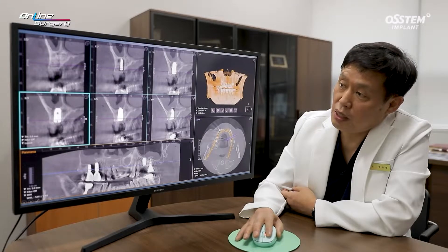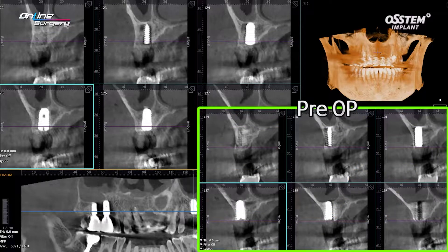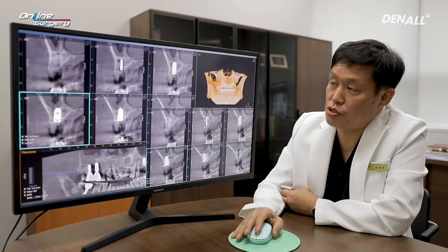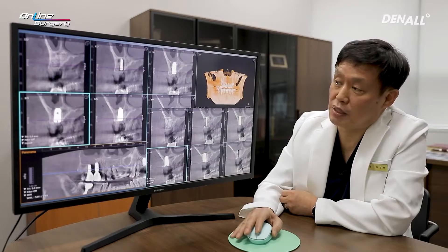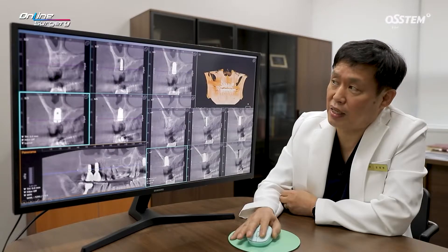In the post-op image, you can see space in the buccal area. I did not damage the buccal plate, and therefore I used autogenous bone graft materials. Buccal plate is still present. I did not use a Trephine Burr — instead, I used a high-speed fissure burr and gained fulcrum to avoid buccal plate damage. We were able to place the implant in the desired position because there was residual palatal bone. The sinus floor seems slightly penetrated, but the implant was placed nicely.